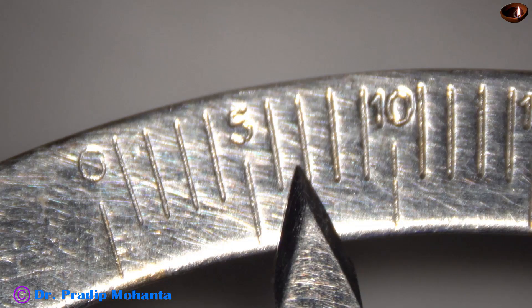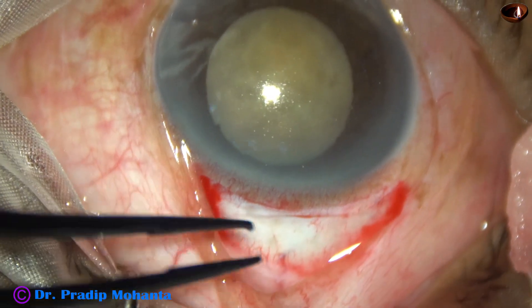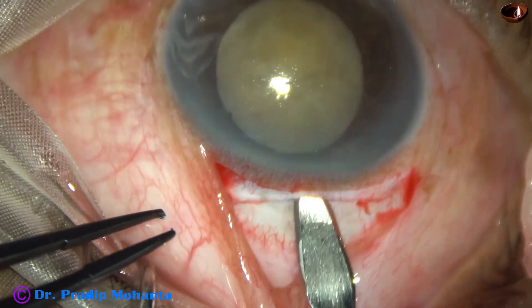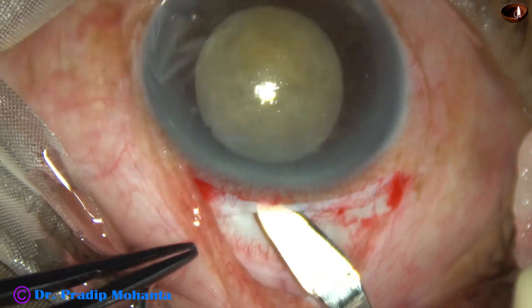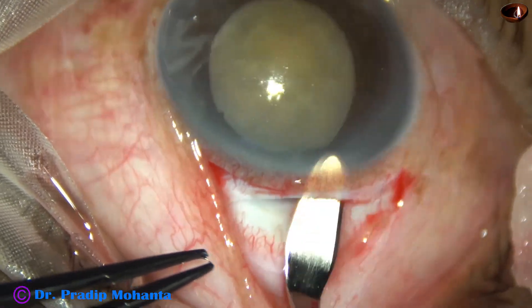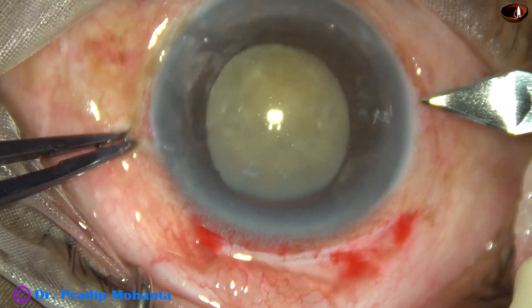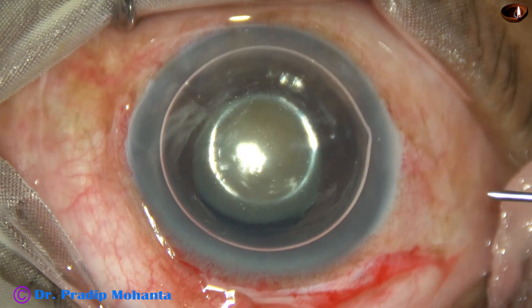This is a 6.75 millimeter incision, about 1.5 millimeters away from the limbus, forming the sclerocorneal tunnel. The inner incision is a little larger than the incision on the sclera, so this is a funnel-type incision.